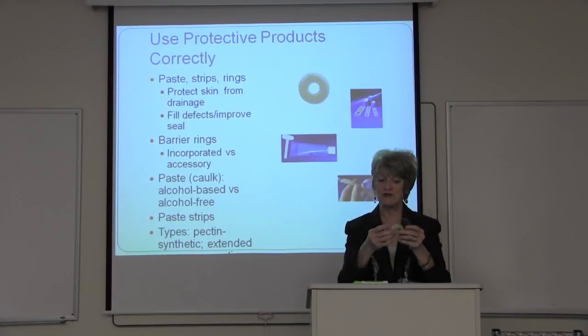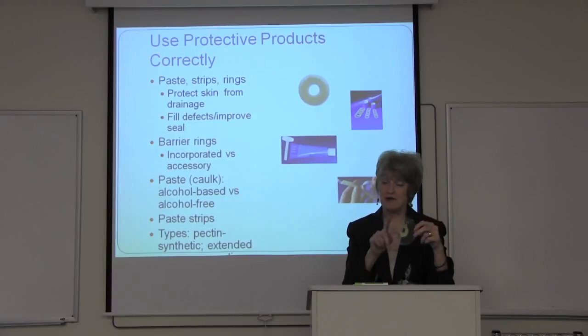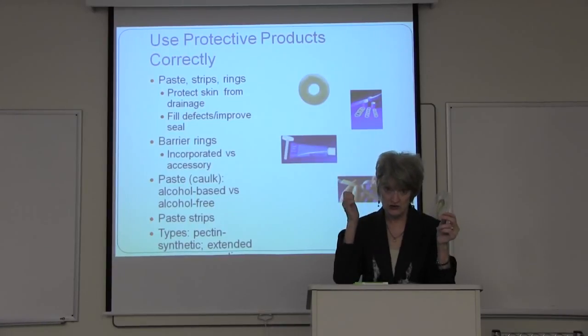Now, are they more expensive than the paste in the tube? Yes. So do I use paste strips as a standard approach? No. But I want to know about paste strips because if I have a patient with significant peristomal skin breakdown, I'm going to need my paste strips because I do not want to use my alcohol-based squeezable paste.